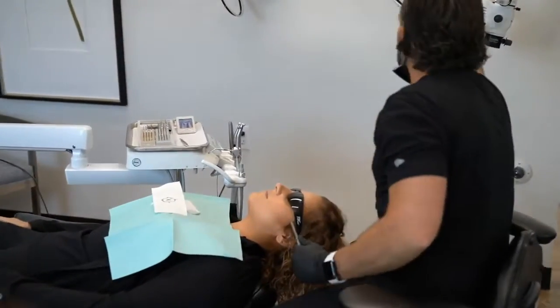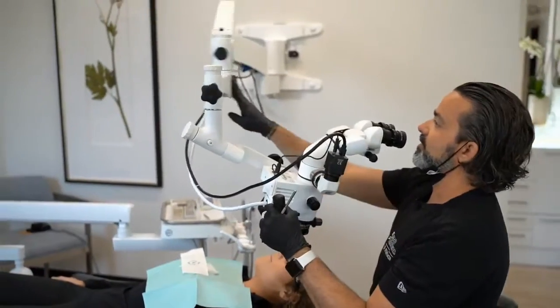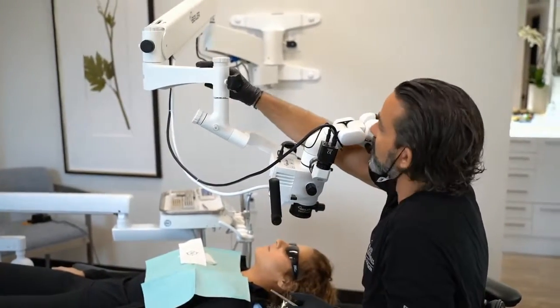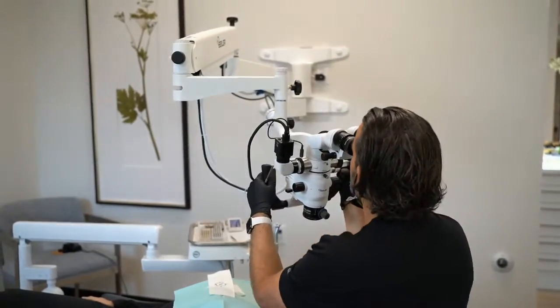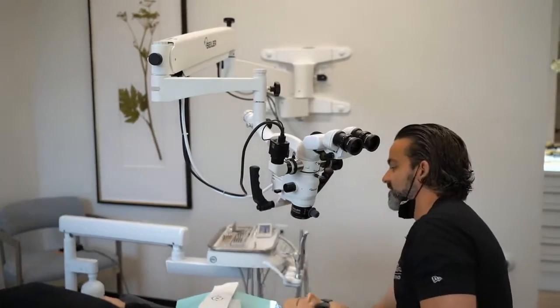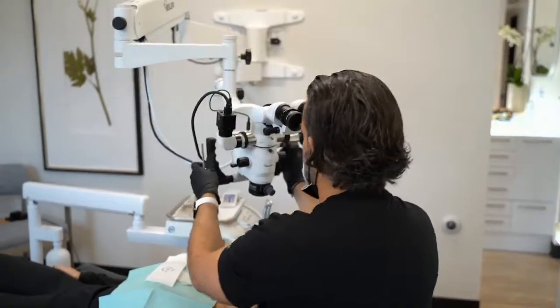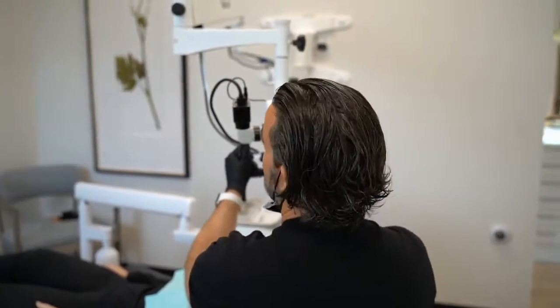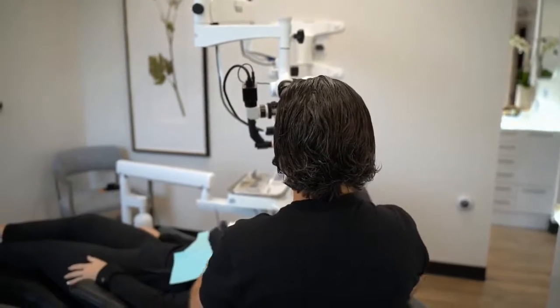And so I'm going to want this extra reach and a kind of a kickback. I really appreciate this lower arm right here as I'm coming around like this. If my chairs didn't swivel, and I was sort of locked in place, then it would become even more of a stretch. And then this is where we would come in like this.